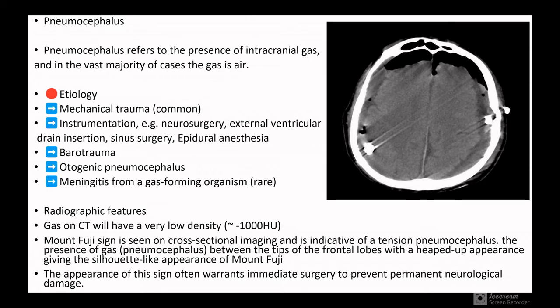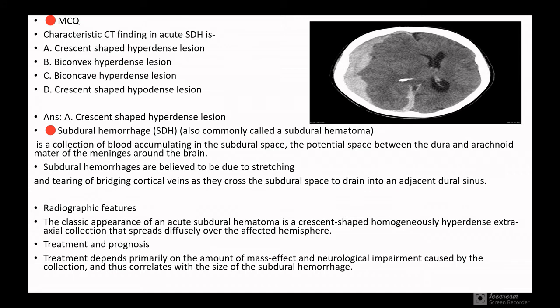Radiological features: gas on CT will have very low density, around minus 1000 Hounsfield units. Mount Fuji sign is seen in cross-sectional imaging and is indicative of tension pneumocephalus. The appearance of gas between the tips of the frontal lobes with a heaped-up appearance gives the silhouette-like appearance of Mount Fuji. The appearance of this sign often warrants immediate surgery to prevent permanent neurological damage.